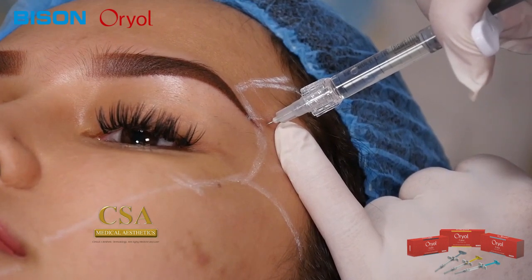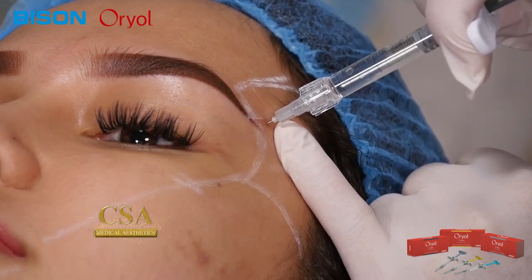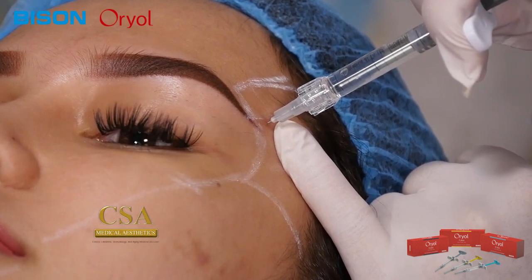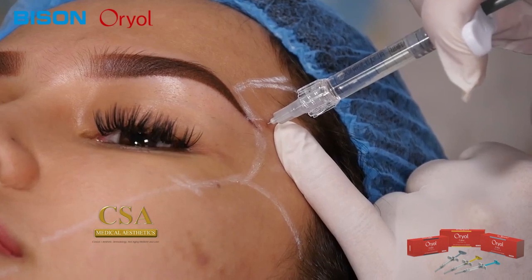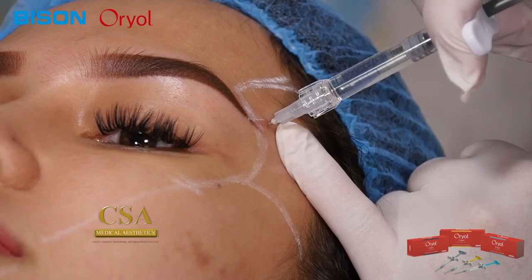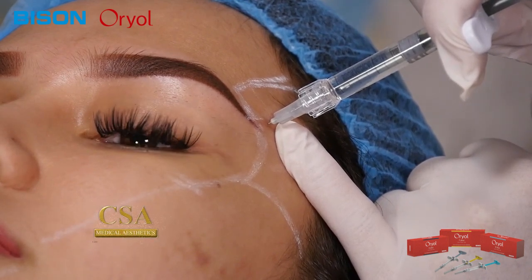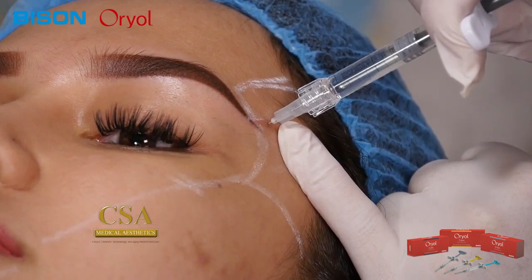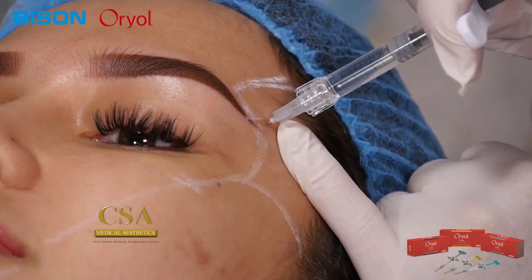which is a high G prime. You need a substance that's more viscous, thicker, or high molecular weight, or a large particle. Since it's high molecular weight, when we push it through that gauge 27 needle, there's resistance. So you have to put in that much effort to push it, pushing with your thumb and filling in that temple area. Okay, avoid your superficial temporal artery, the middle temporal vessels, and deep temporal vessels.